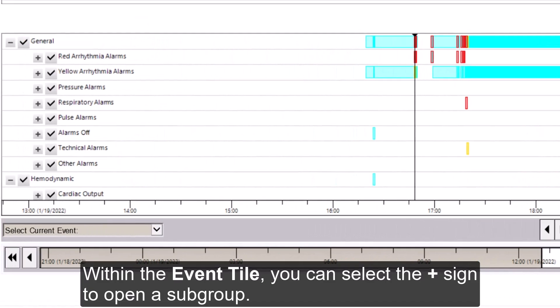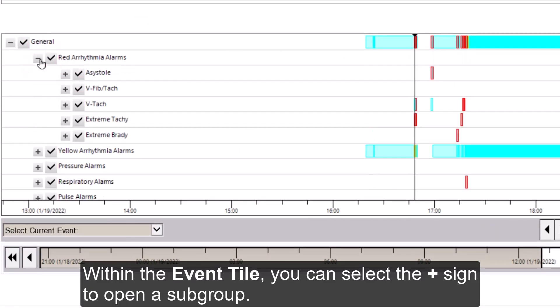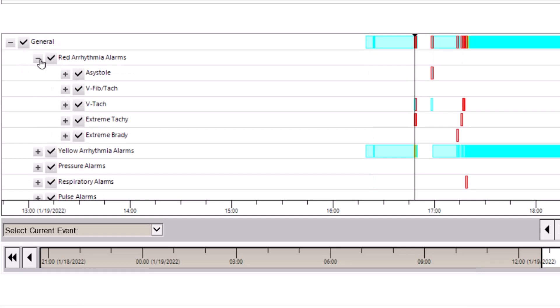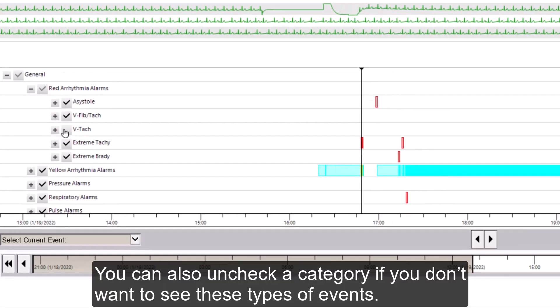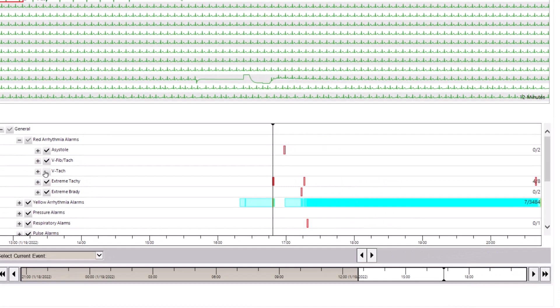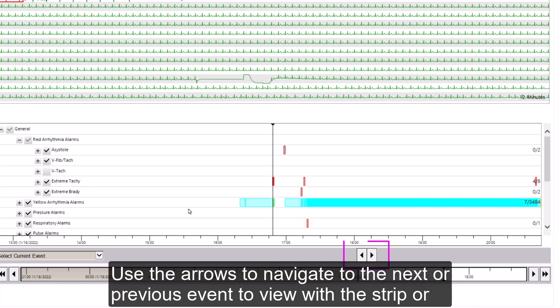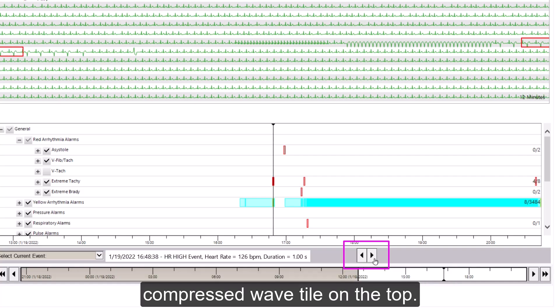Within the event tile, you can select the plus sign to open a subgroup. You can also uncheck a category if you don't want to see these types of events. Use the arrows to navigate to the next or the previous event to view with the strip or the compressed wave tile on the top.